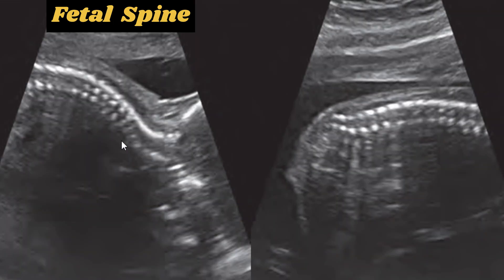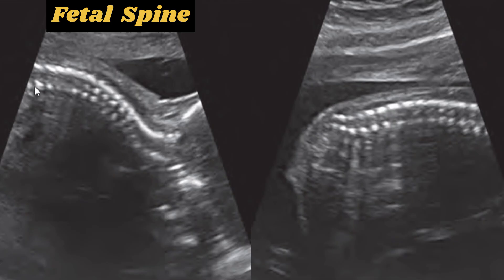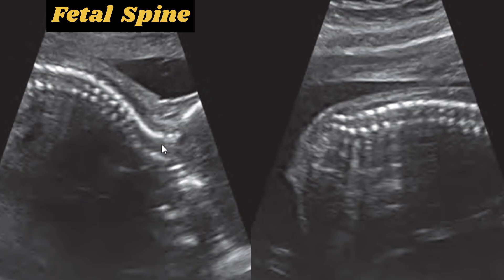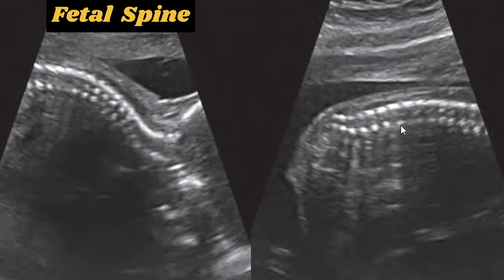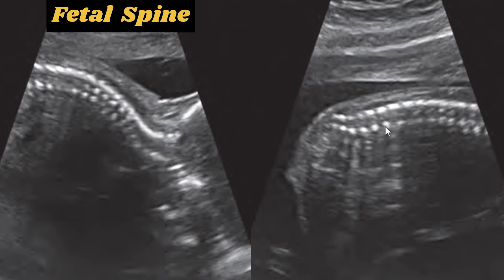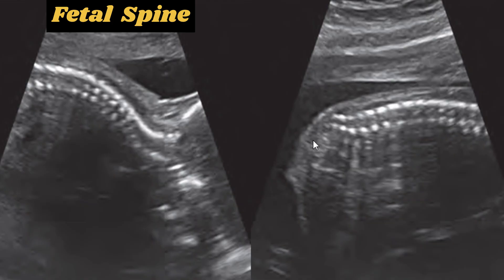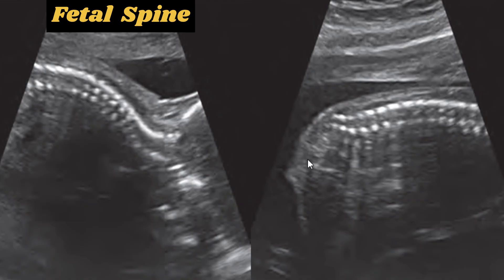Now we are going to discuss the fetal spine. In this longitudinal scan plane, the midline sagittal image of the cervical and thoracic and lumbosacral spine shows a normal appearance, including the normal distal tapering of the bony elements in the sacrococcygeal region.